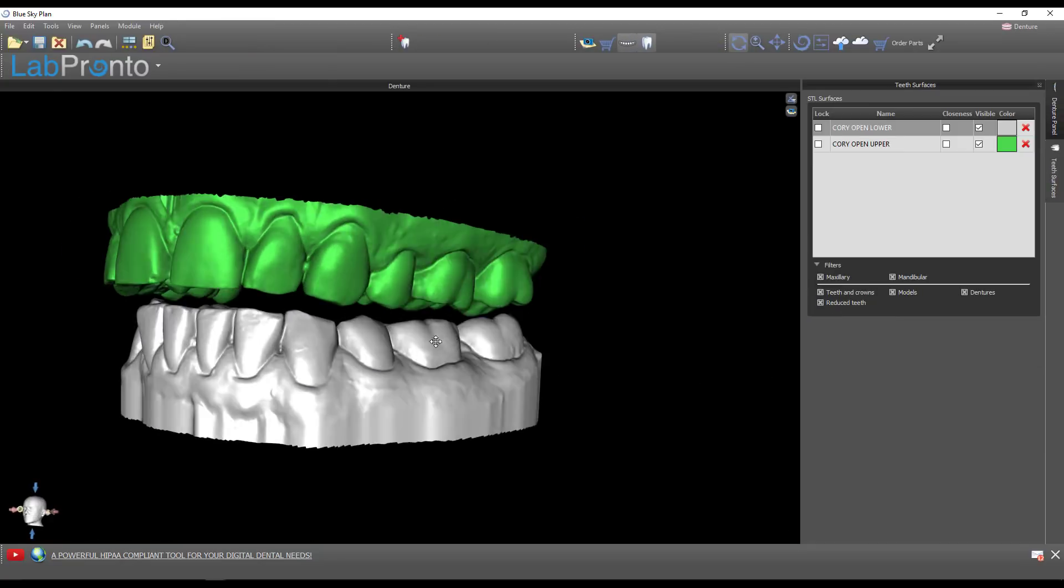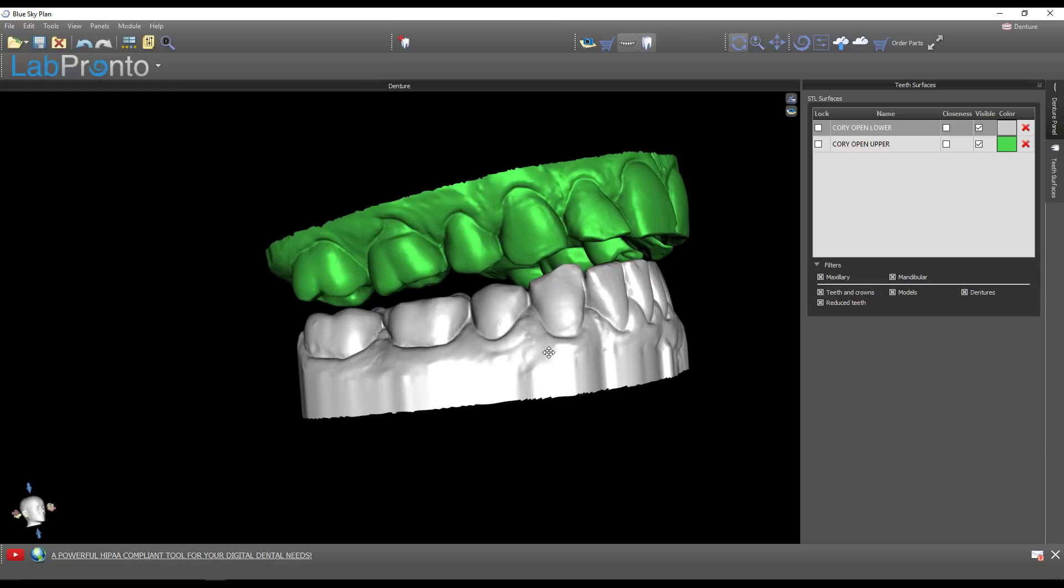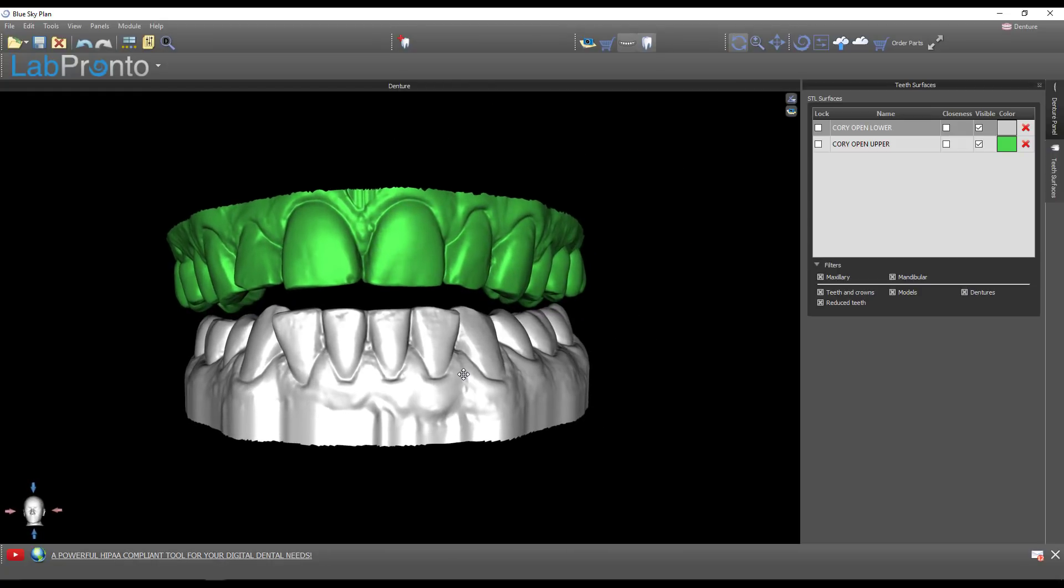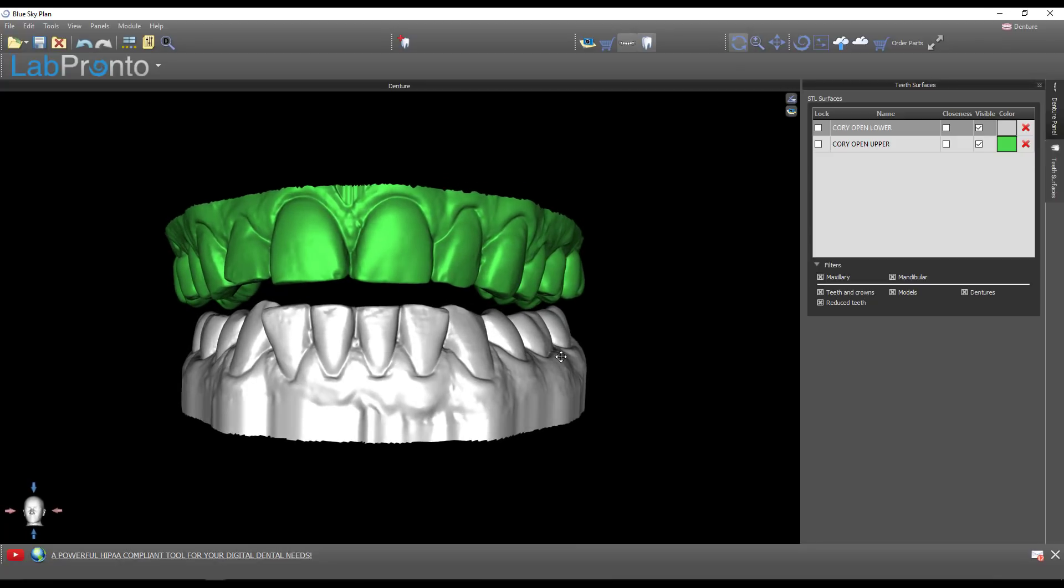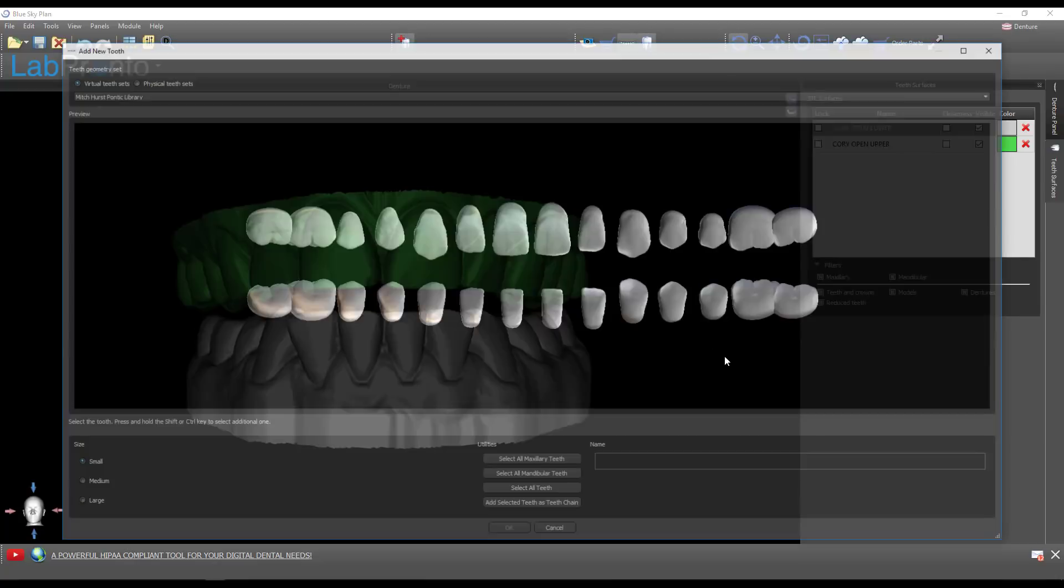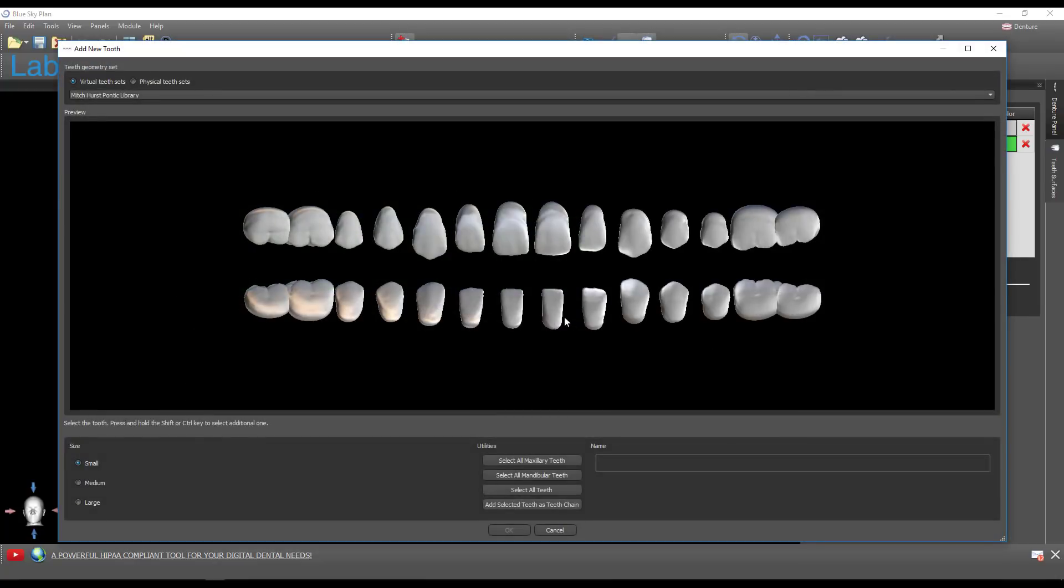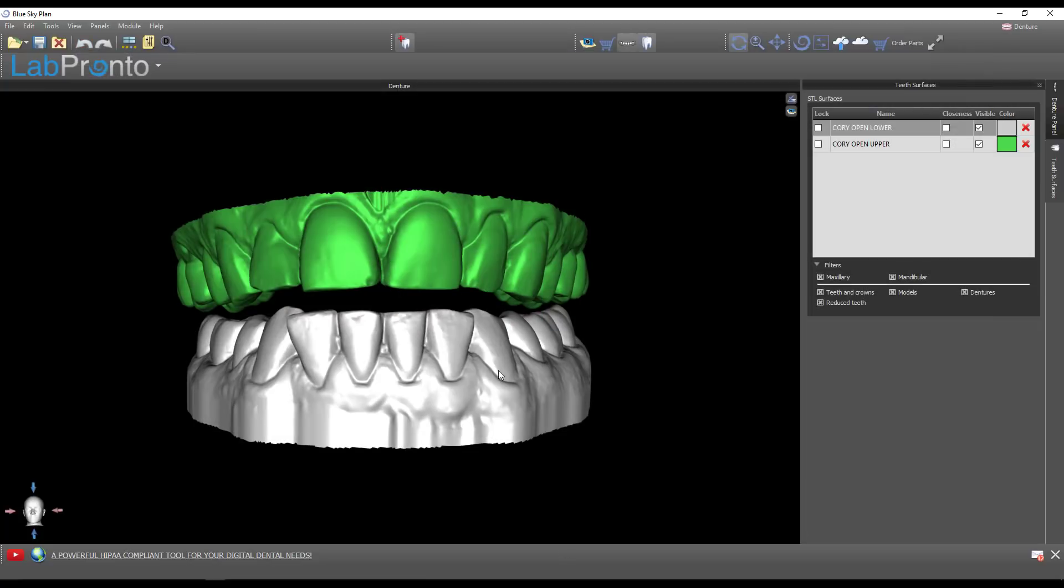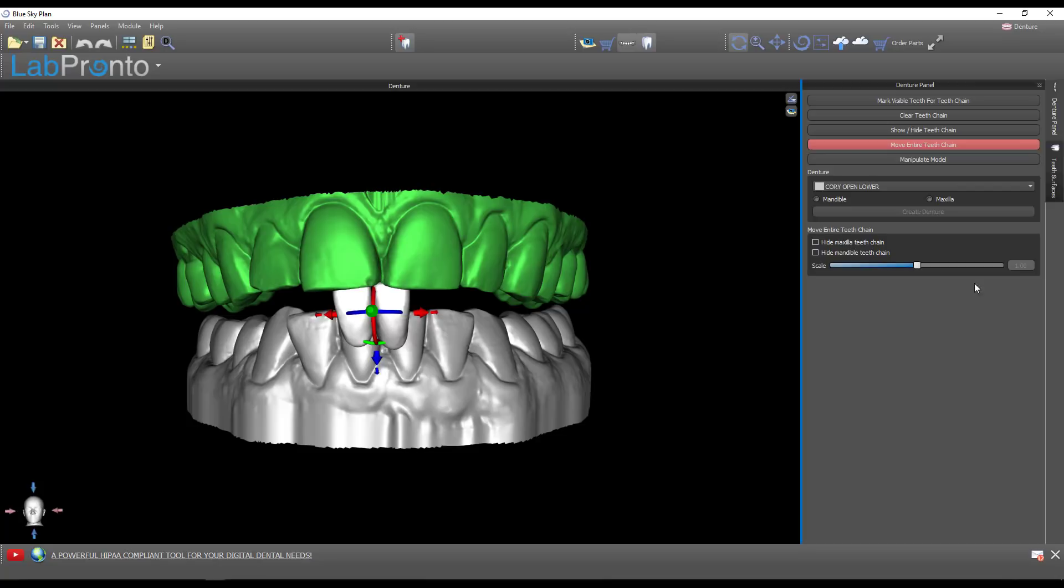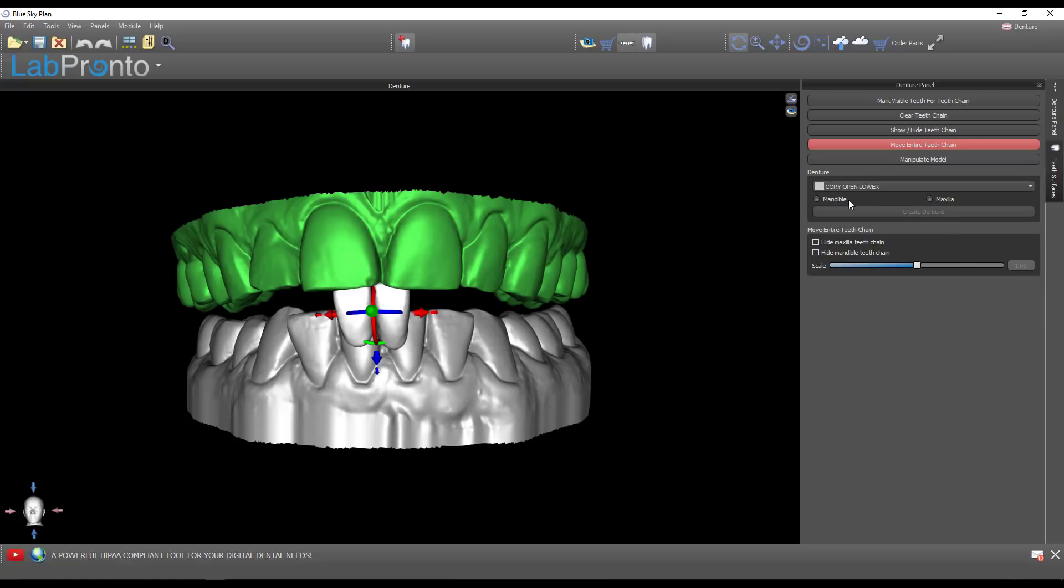We're in the denture module now. Because this is a hack, you're not going to be able to begin fabricating a denture unless you first put in a couple of teeth. We're going to make a lower night guard. I'll choose two random teeth, add selected teeth as a chain, hold down shift and drop those in. The software thinks it's making a denture and the denture base is what will become the night guard. We can turn those teeth off from this point on.